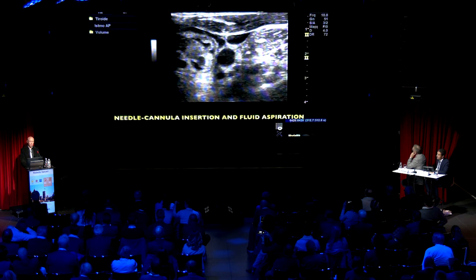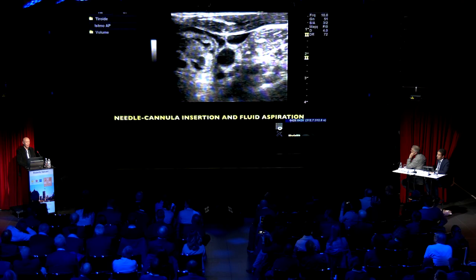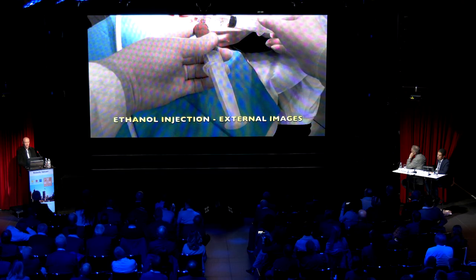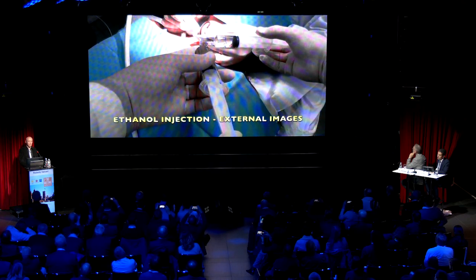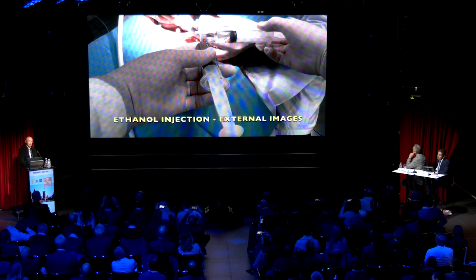And I try to have a complete drainage of the cyst, at variance with some others who recommend using the standard steel needle and recommend to leave some fluid inside. And then the cyst is washed several times with alcohol until clear fluid is obtained, yes, this is the assistant, and now clear fluid is obtained.